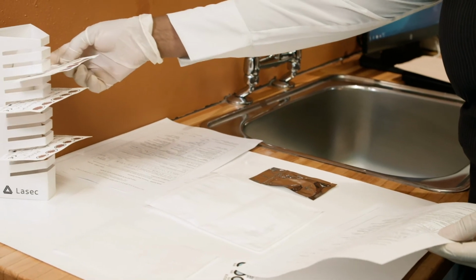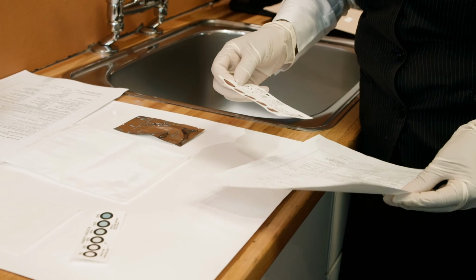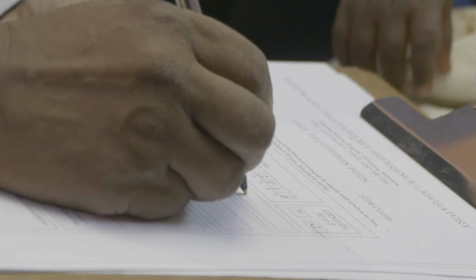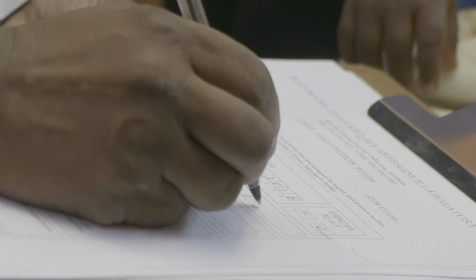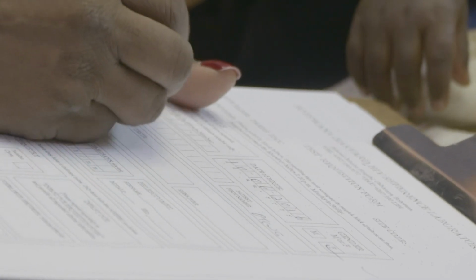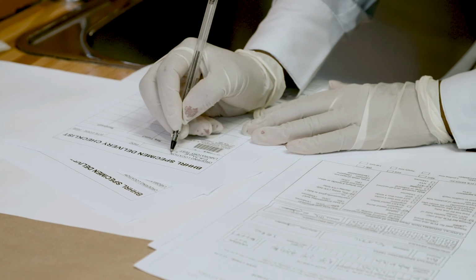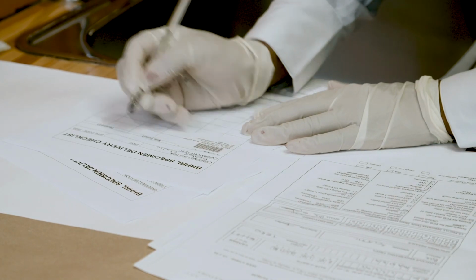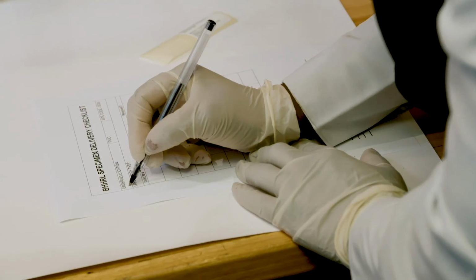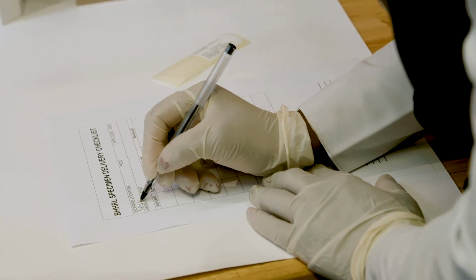As you send out the specimens for analysis, it is critical to check that each sample is properly labeled and entered in the logbook. Be sure you have completed all paperwork necessary to track each DBS. Make sure that each sample has its corresponding laboratory requisition form and that all samples are entered in the summary sample list that accompanies the samples to the laboratory. This form helps the lab know how many total samples were shipped in the envelope. These procedures are important to facilitate the return of results.